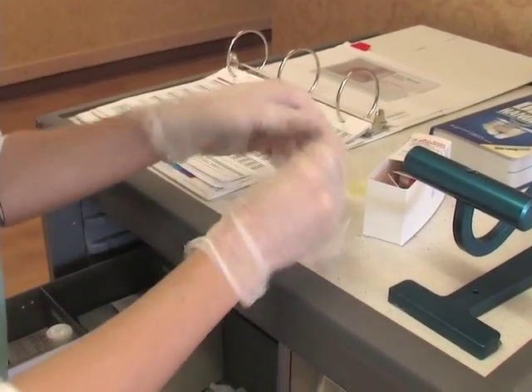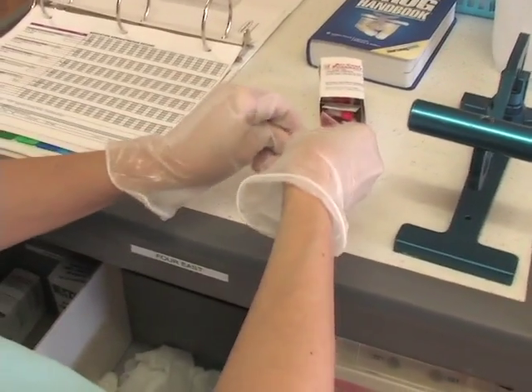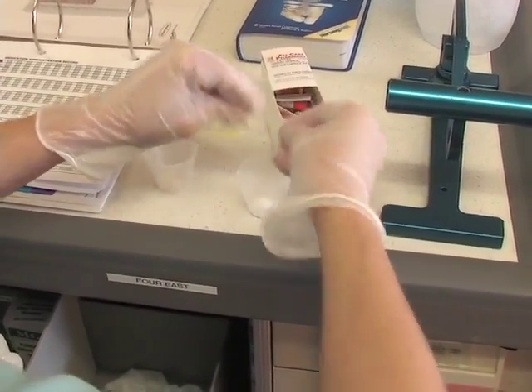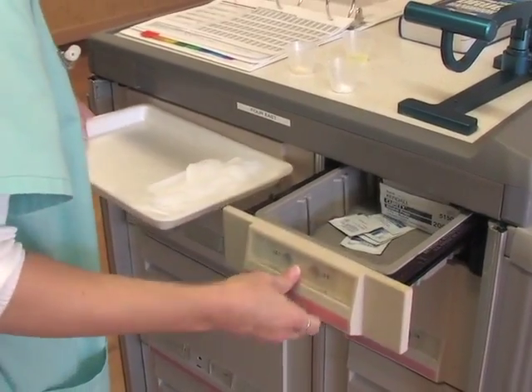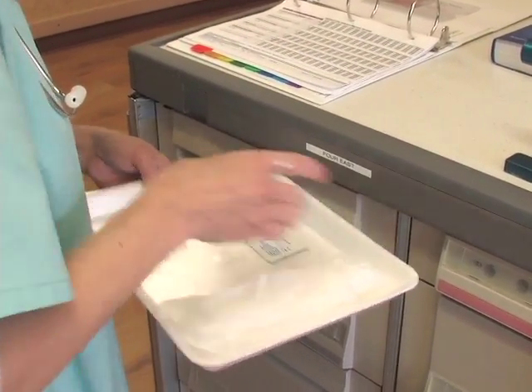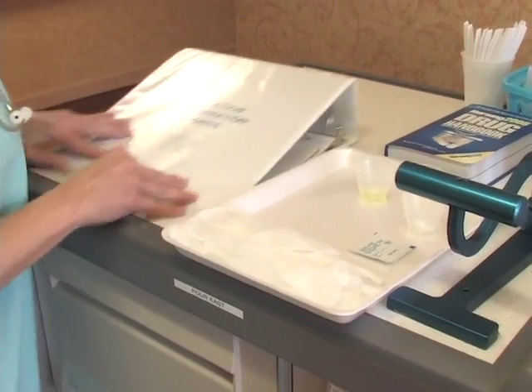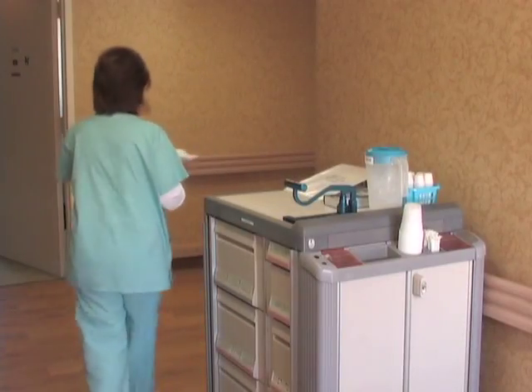Note that the nurse is placing each medication in a separate cup. She will use the pre-measured water at the bedside to dilute the medication prior to administering through the G-tube. It is recommended that all medications, even liquid forms, be administered with dilution. The nurse places gloves, an alcohol pad, and all individually prepared medications on a disposable barrier. She then closes the medication administration record book, ensuring the privacy of all information contained within, and locks the medication cart. After cleansing the hands with an approved hand sanitizer, she is now ready to approach the resident.